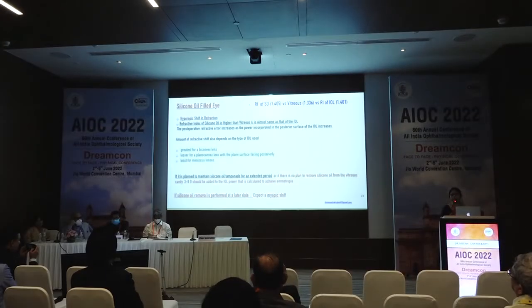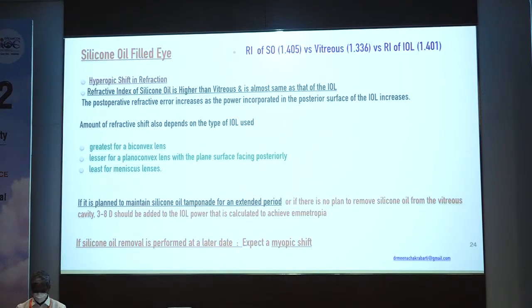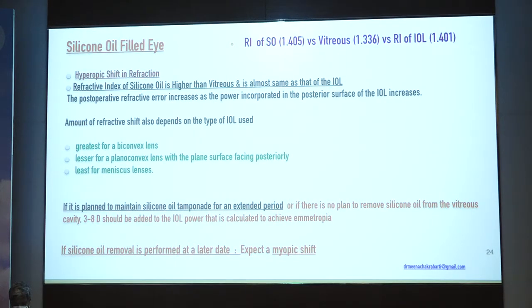Now that you have calculated the axial length in patients who have silicone oil in the eye, there is the decision of whether to remove the silicone oil or retain it in the eye. If you have a compromised posterior segment, most of us retain the silicone oil in the eye, which is bad both for the surgeon as well as for the patient. And in these cases, you have to bear in mind that the refractive index of silicone oil is different from that of the vitreous and almost similar to that of the intraocular lens that you implant in the eye. So when the back of the lens comes in contact with the silicone oil, that acts as a single unit and it neutralizes the power available at the back of the lens.